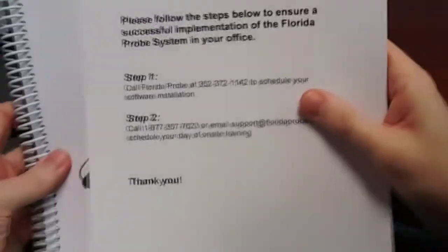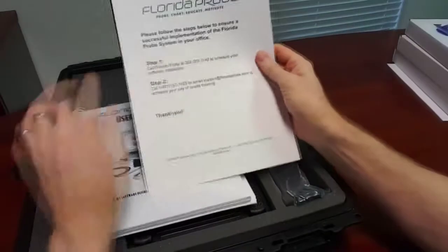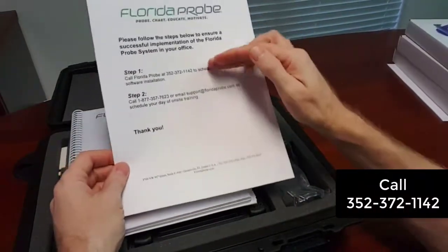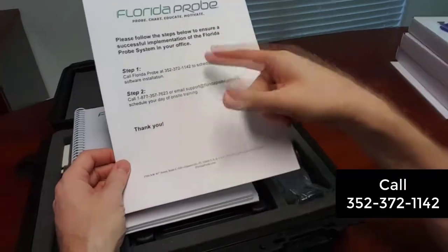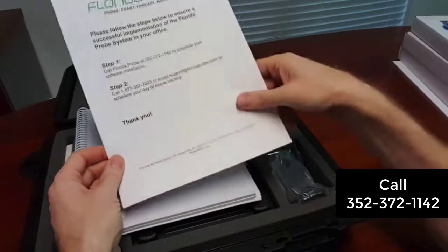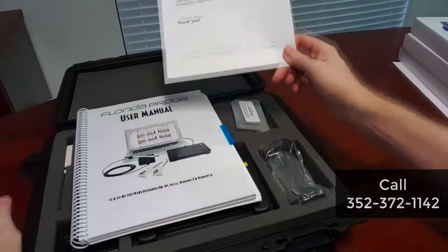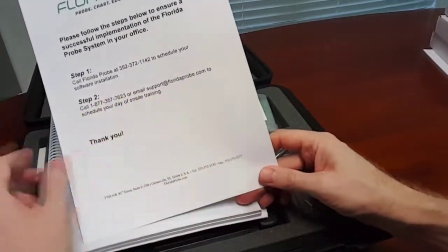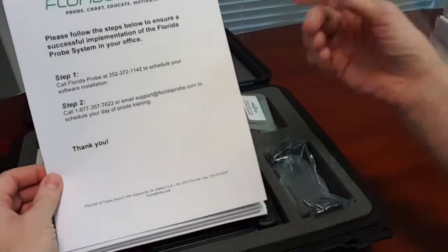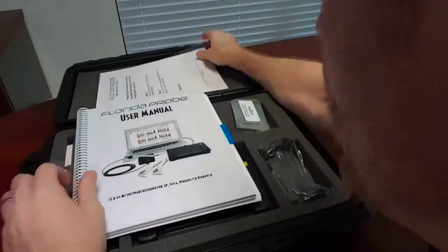Inside is your user manual. You've also got another letter reminding you to go ahead and schedule your software installation, which happens remotely to your entire network, and then to set up your actual day of on-site setup and training. Typically they're training two to three people — usually the dentist, two hygienists, and maybe one or two staff members up front.